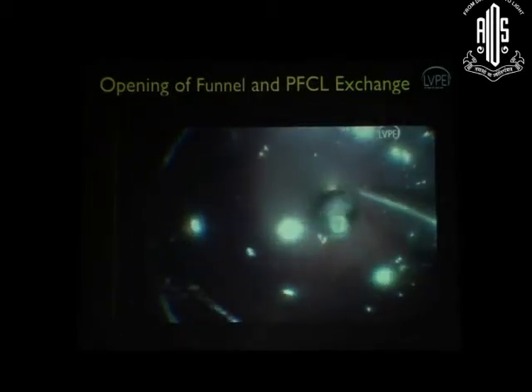So the reason why I'm showing this clip is that I wanted to highlight where to keep your aspiration of fluid. You look at that, it's not on the surface of the retina. You'll see the edge between the fluid and air, and keep it there till the level goes off completely and then goes into the center, so that you don't have a possibility of slipping of the flap. That's something which you should always make sure that you do.